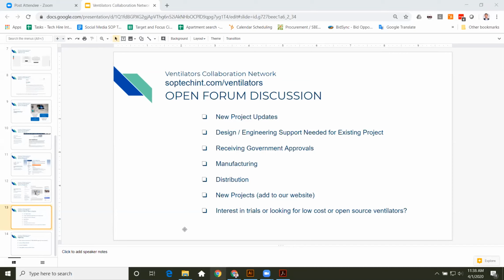I'm not sure it makes a lot of sense to ask the question of motor selection, because there may be different designs that have different requirements, right? There's not going to be a single motor that solves the problem. And one of the problems that we may face is a limitation in our supply chain as well, if we're really trying to build 1 million of these.